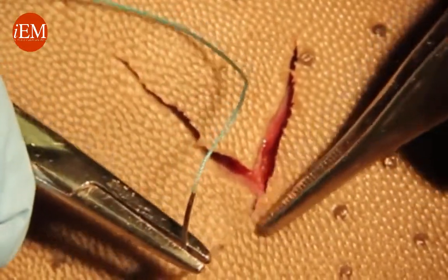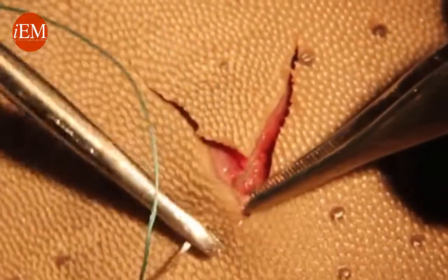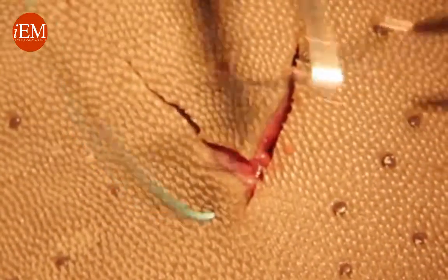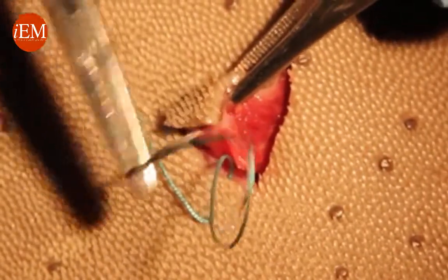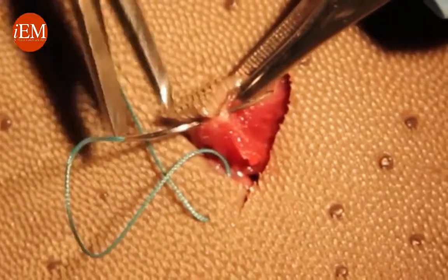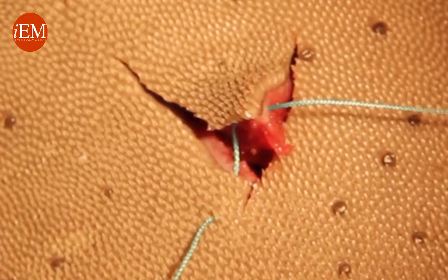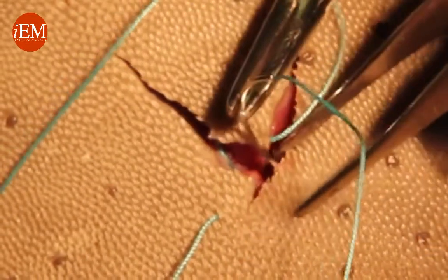We grab the edge and come through the subcuticular, then grab the corner but don't go through the tip. You want to go underneath from subcuticular to subcuticular, then go on the other side and go subcuticular to skin.